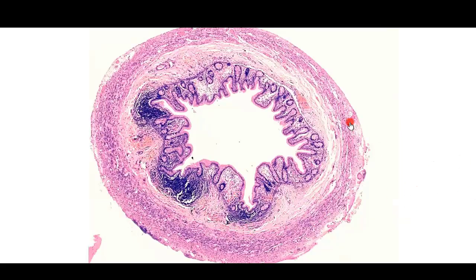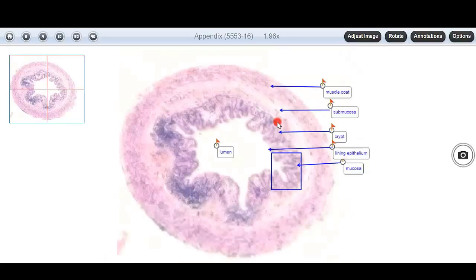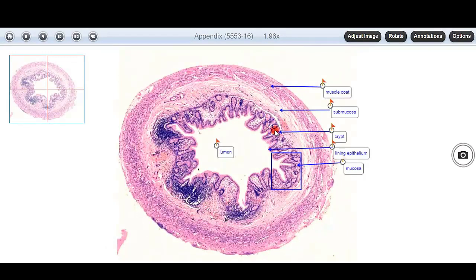Now we will recapitulate the histology of the normal appendix. The appendix is divided into 4 layers: mucosa, submucosa, muscularis propria, and serosa.